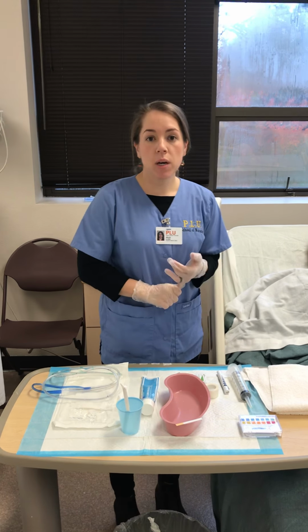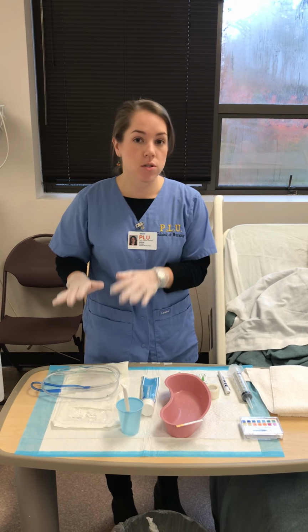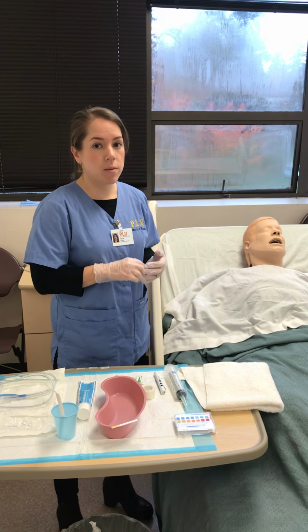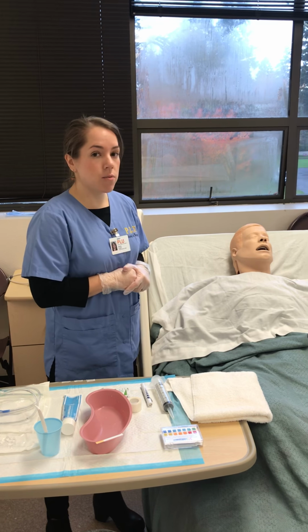I have reviewed my orders and I know what procedure I need to do. I need to remove some contents from the patient's stomach, so I know that I need to use a large bore tube. I've gone over the procedure with the patient. I've obtained informed consent. I have identified the patient with 2 identifiers, and I've also done a focused assessment.